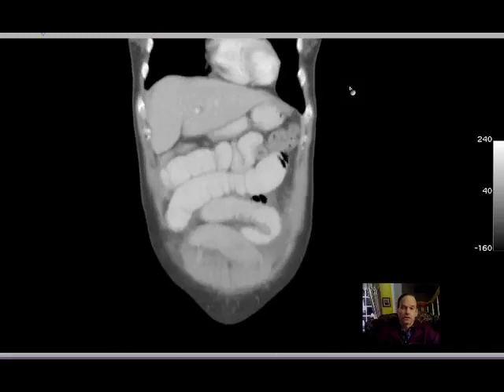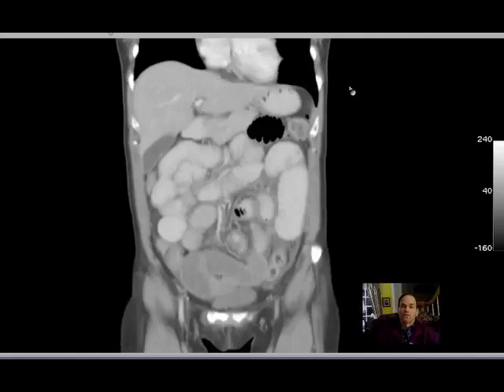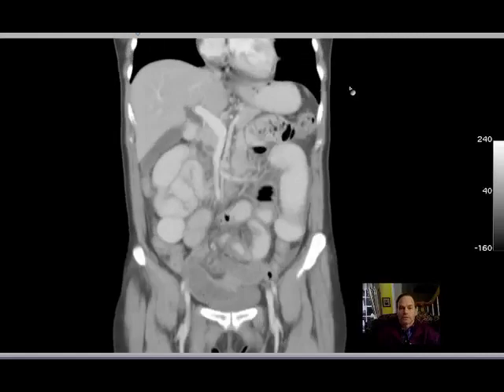And the truth is, in the past, it used to be a real difficulty for the clinician to decide if someone had a serious abdominal situation, such as small bowel obstruction that often requires surgery, or if it was just a stomachache of whatever sort.